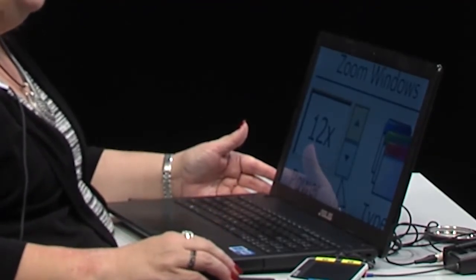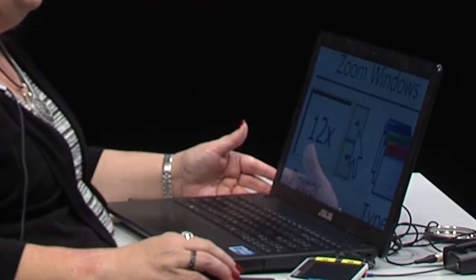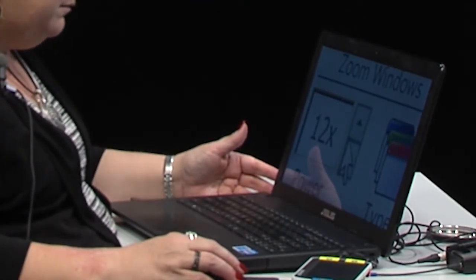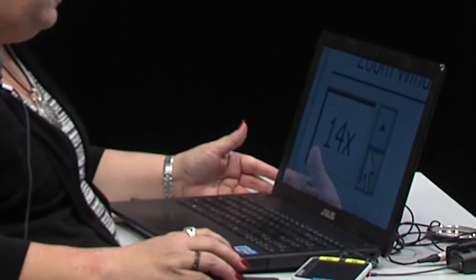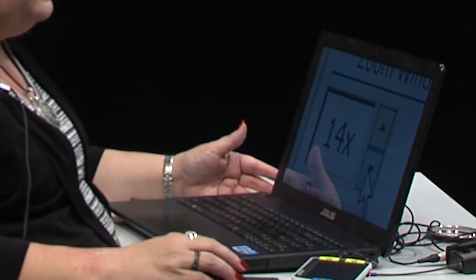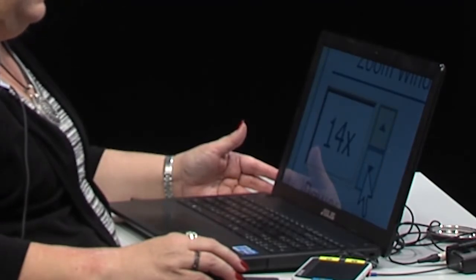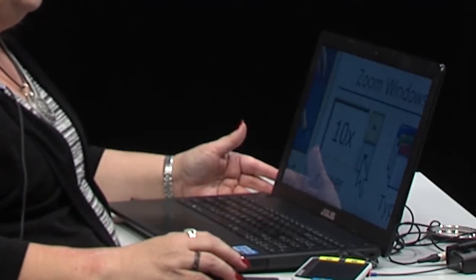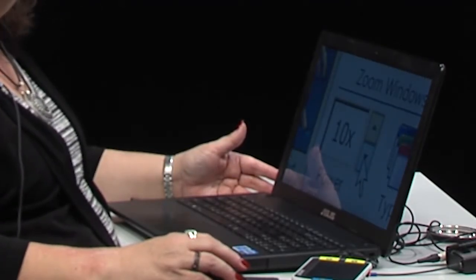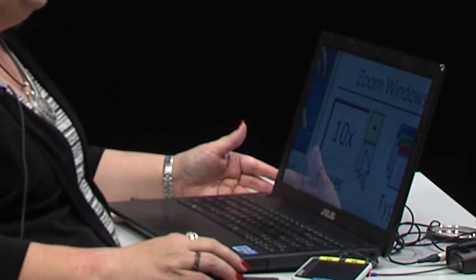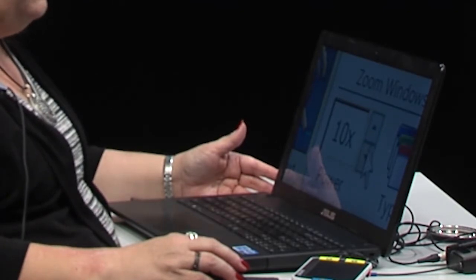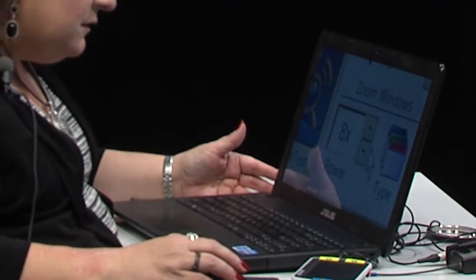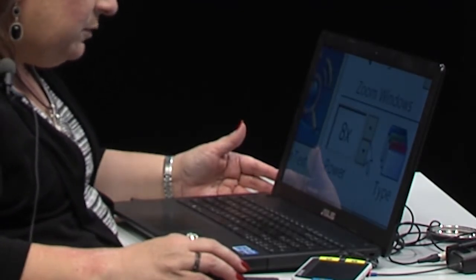I can adjust it with the up arrow to 14X, or the down arrow to 10X. It just depends on what I'm reading, but normally my default is on 12.